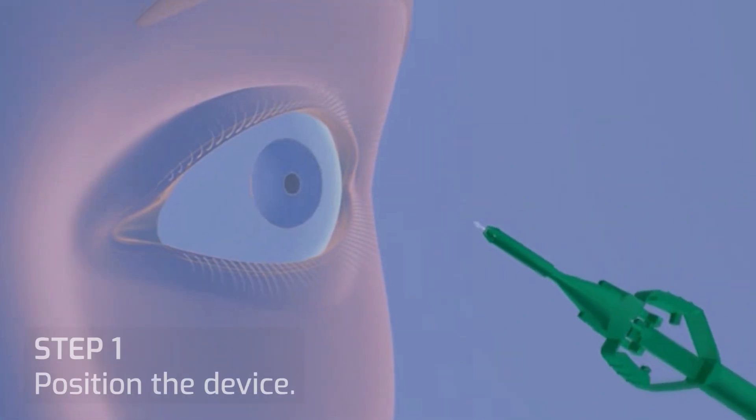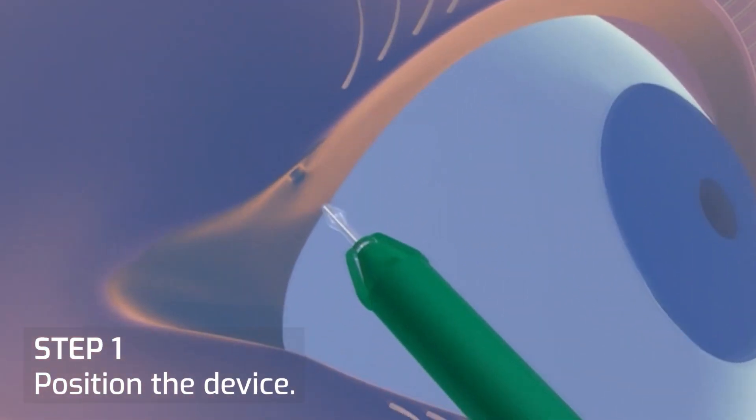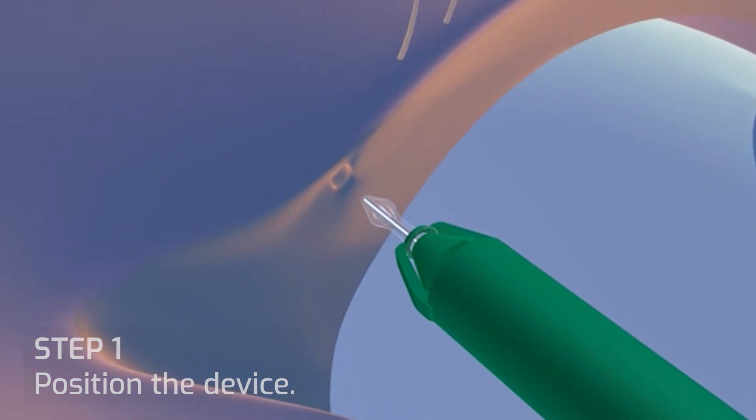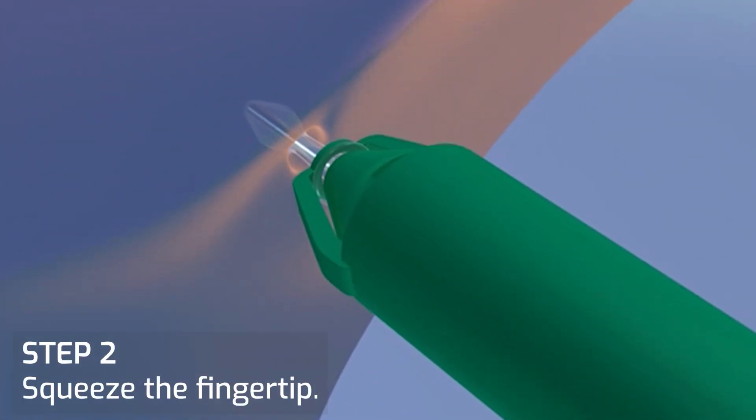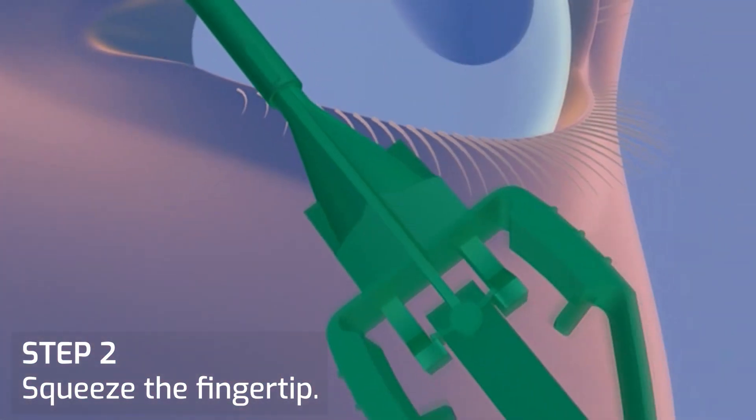Start by inserting the painless plug in the punctum using the plug inserter. The painless plug is correctly placed in the punctum when the collarette is the only visible part of the plug.